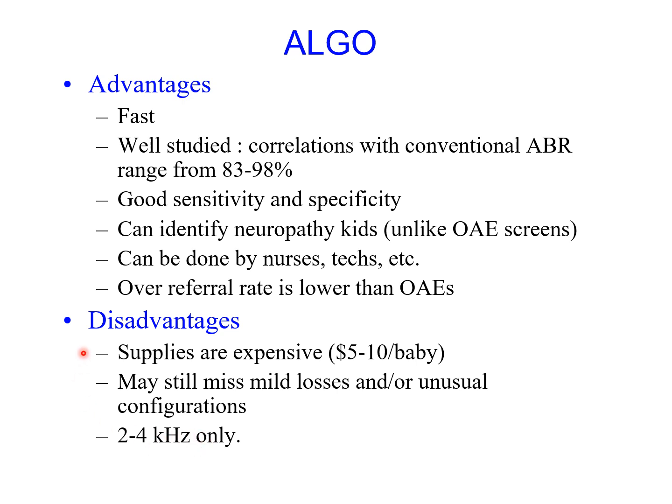So these are the disadvantages of using ALGO. So in terms of the pros and cons listed here, you be the boss, because pretty soon you will graduate and have your license, have your own clinic. Then whether you want to use ALGO ABR for screening or you want to use OAE for screening, it's up to you.